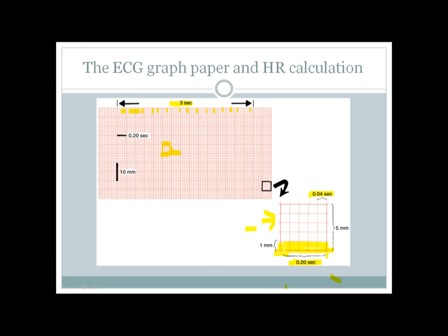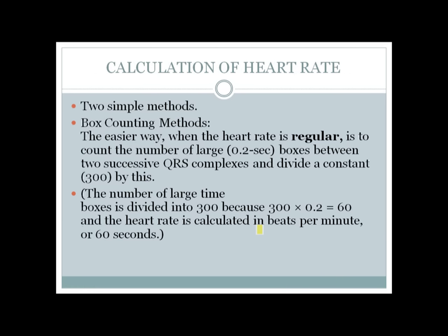And this is about the horizontal axis, and in the vertical axis you have another small 5 boxes height, and each of those boxes is denominated as a 1 millimeter box. So those are 1 millimeter boxes, and as the ECG is a time-voltage graph, the time is plotted in the horizontal and the voltage is measured in the vertical area. So the 1 millimeter area will actually measure the voltage, and that produces a deflection, an upward deflection or a downward deflection. So those are the basics of the graph paper of an ECG. I think that clears this all.